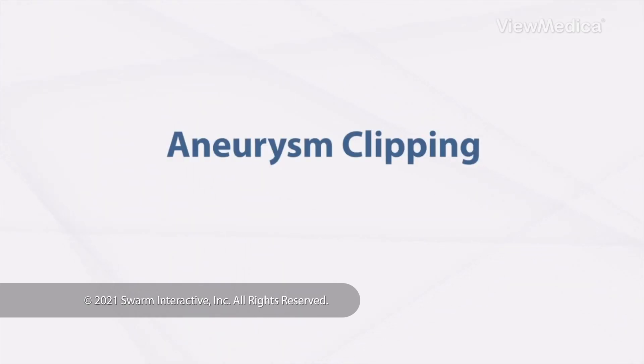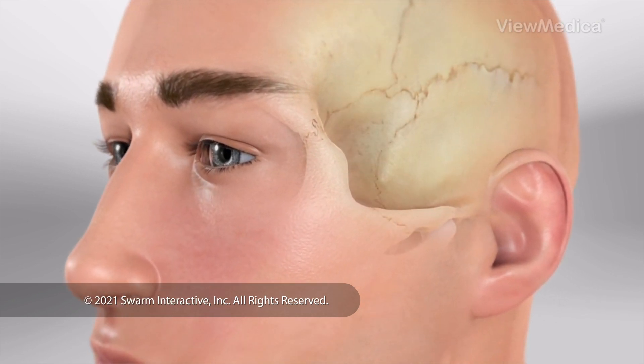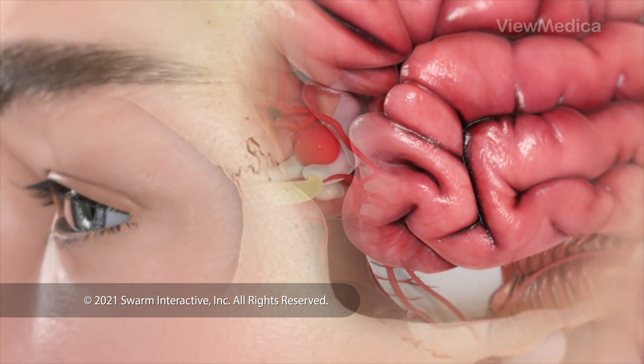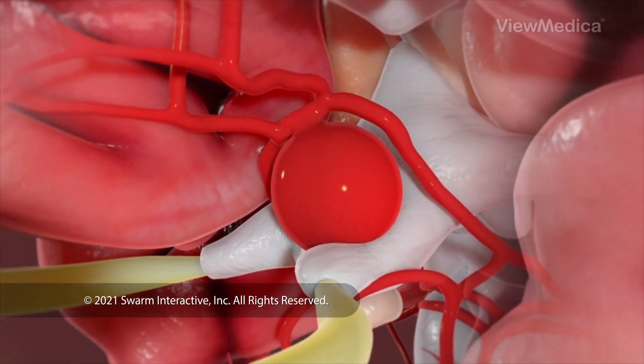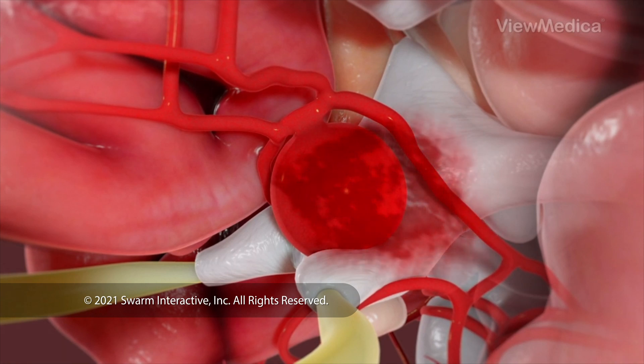Aneurysm Clipping. This surgery treats a bulge in the wall of an artery in your brain. We call this bulge an aneurysm. This surgery can stop bleeding from an aneurysm. It can also prevent the bulge from leaking or bursting in the future.